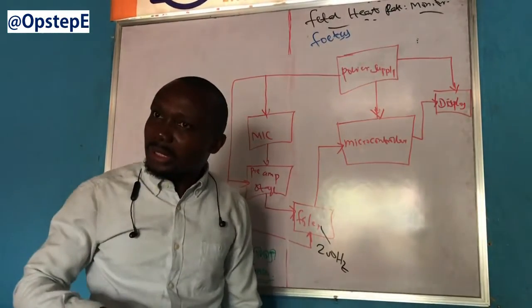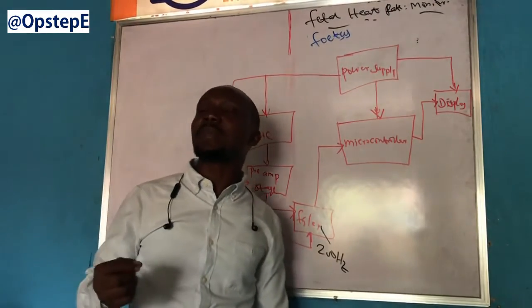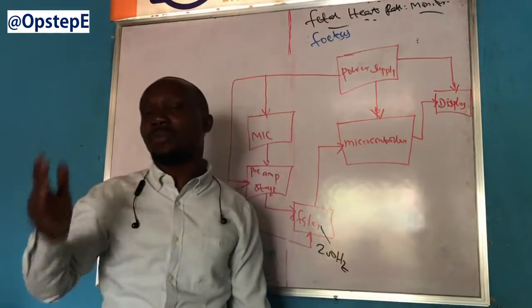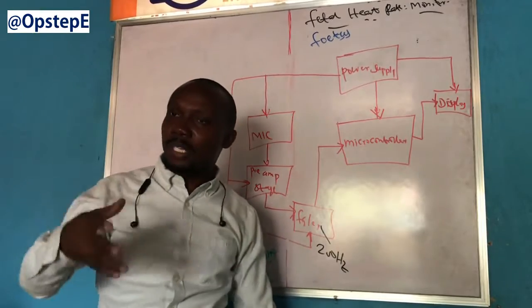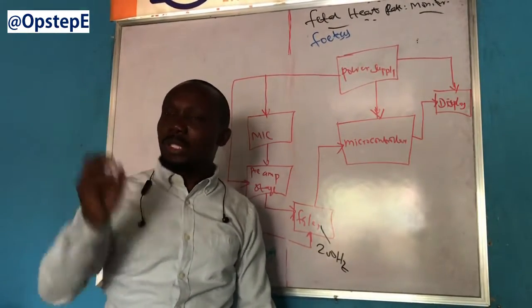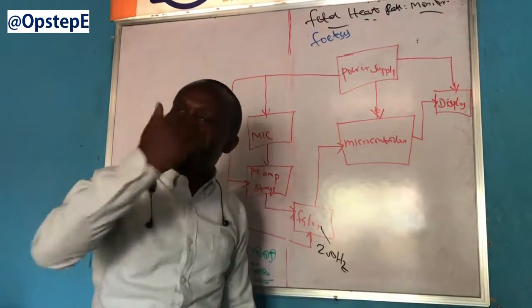That is not what the baby is actually doing. If we say, okay, let's pick every 1 microsecond sound and find how many microseconds we find in 60 seconds, because don't forget, the unit of our result is going to be in beats per minute. And beats per minute means we need to read those pulses for 60 seconds to be able to have an accurate answer.